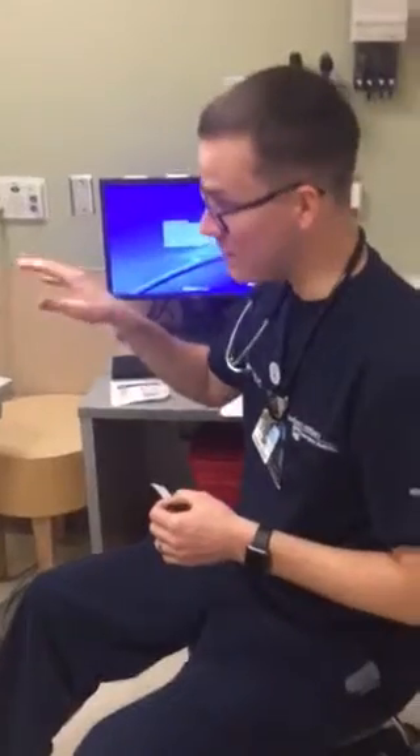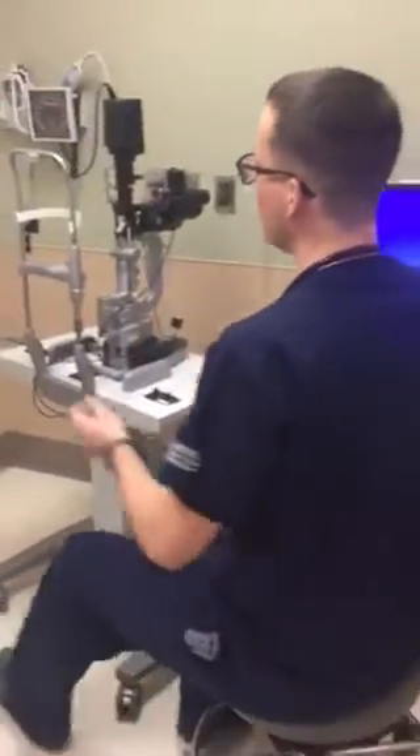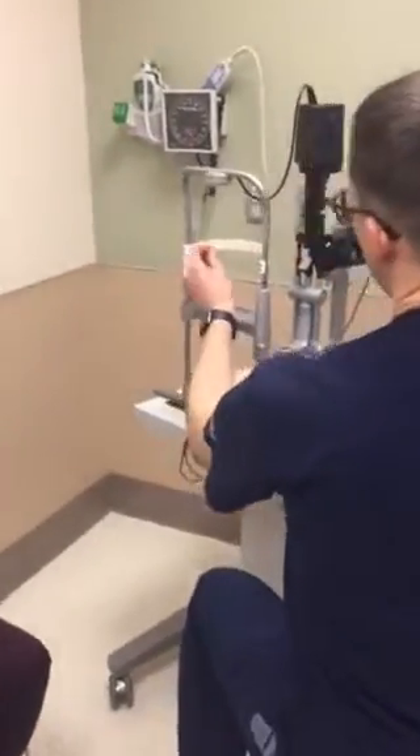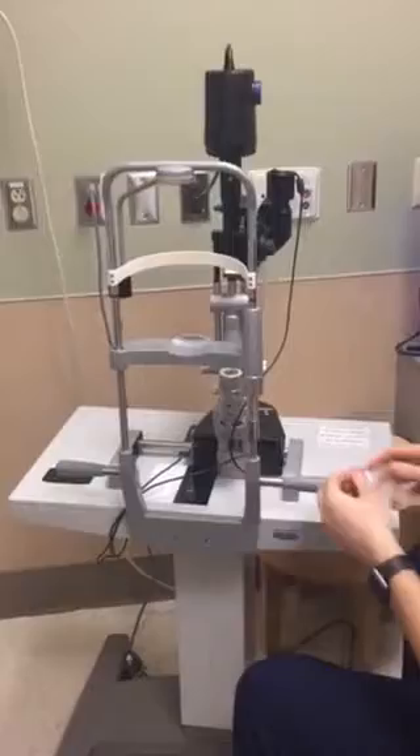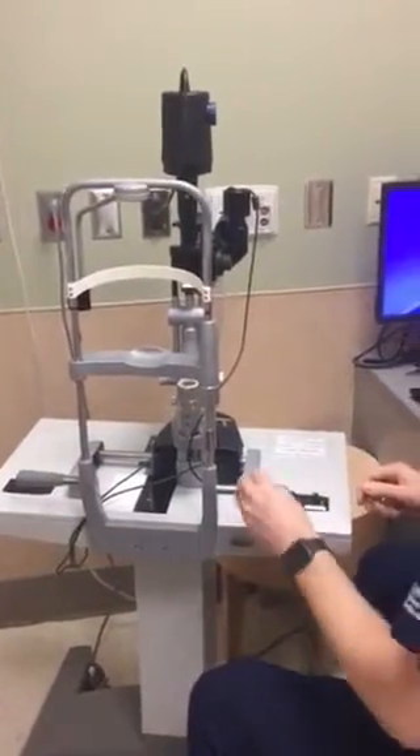Once you've gathered all your supplies, the first thing you want to do is disinfect the slit lamp. Nobody really knows who the last person was that touched it — whether it was a snotty kid or somebody with conjunctivitis — so go ahead and do yourself and the patient a favor and disinfect the areas the patient's going to be touching. I just use an alcohol swab. It also gives your patient a little bit of reassurance.